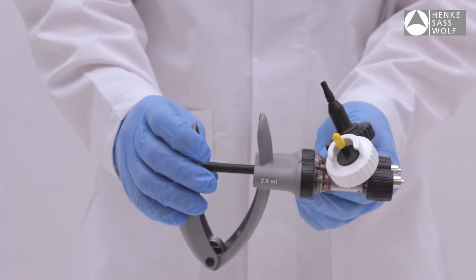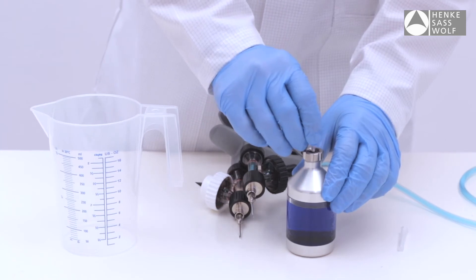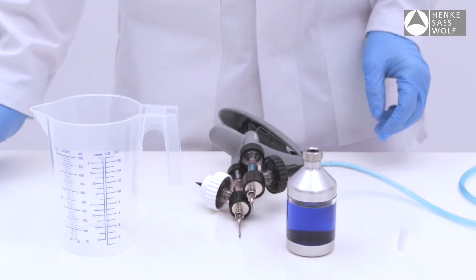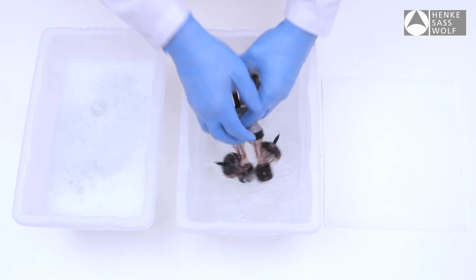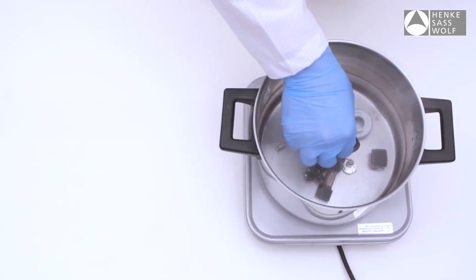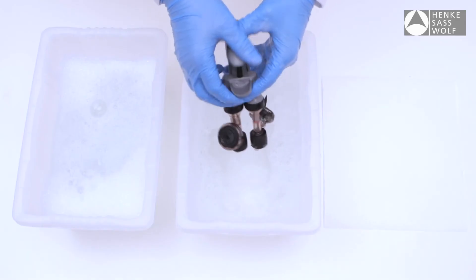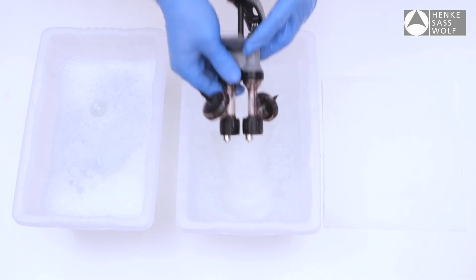There may be a piece of bottle rubber stuck in the syringe, which can occur if care is not taken when inserting the bottle on the spike. Always pre-puncture the bottle rubber with a clean needle prior to attaching the bottle. To clear the blockage, submerge the syringe in clean water and pump vigorously 10 to 20 times. If this does not help, boil the syringe for 20 minutes then pump through in clean water to loosen any blockages.